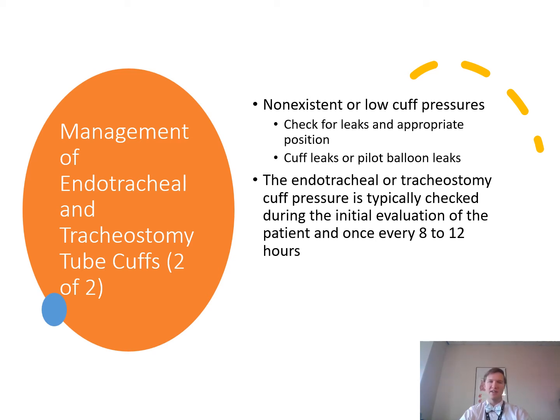But simply leaving the stopcock on the pilot balloon will temporarily solve the problem. It's not a permanent solution, it's a temporary solution. And the tube should be changed if possible, right?